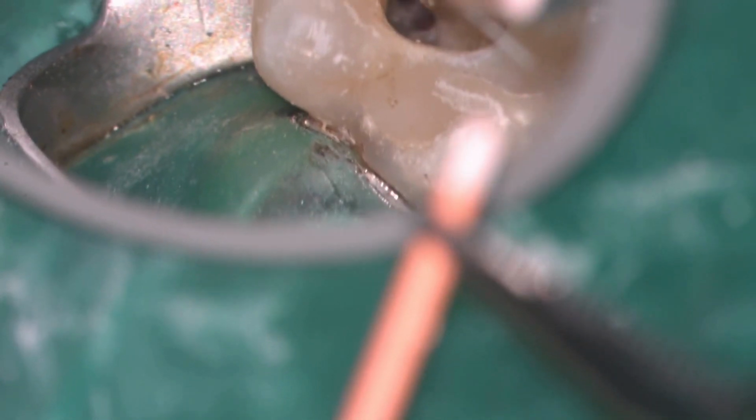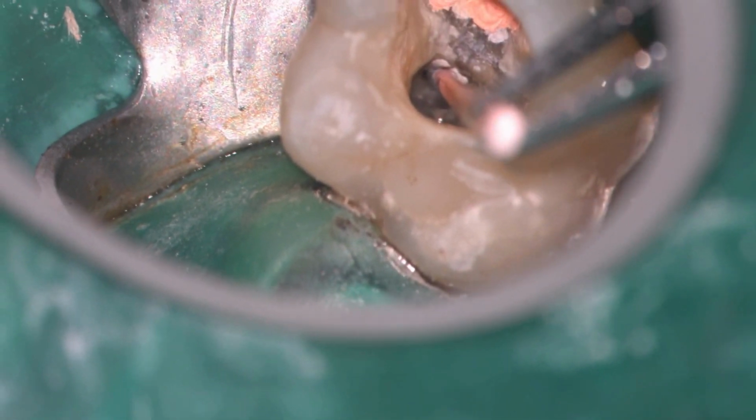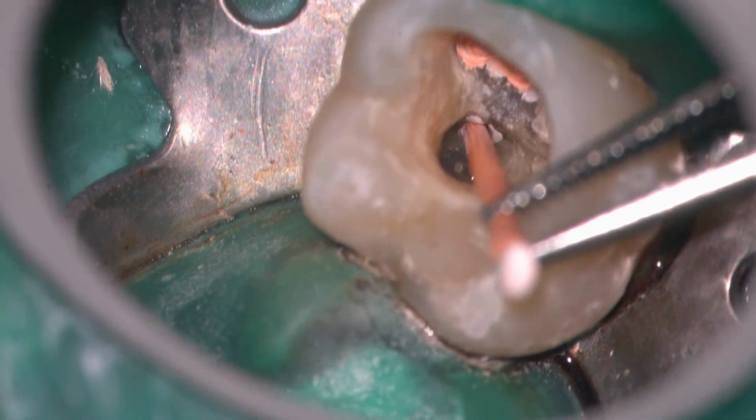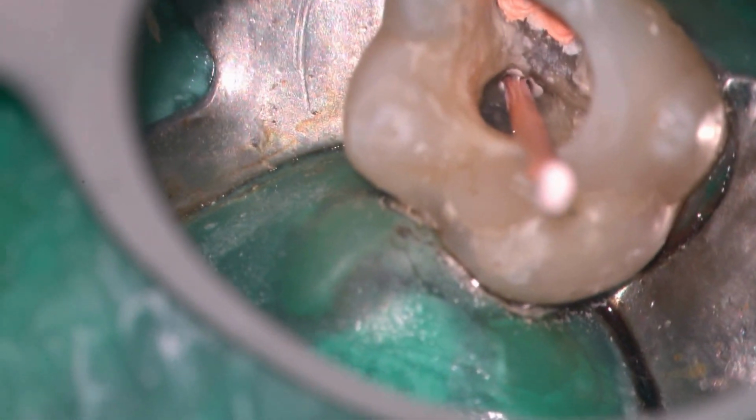A lot of people have asked me, how do you fill the apical portion of a canal with coronal resorption without getting the gutta percha and sealer into the resorption prep? Well, the answer is carefully. You can do this by coating the apical end of the gutta percha with a light coat of sealer, placing it, being very careful, searing it off at the orifice at the level of the deepest portion of the resorption prep. And if you have good direct line access, it's actually not that difficult.